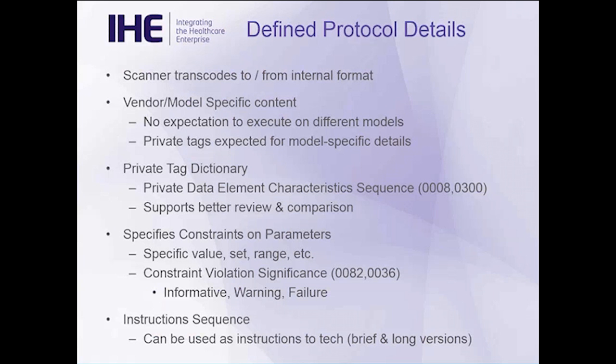So the defined protocol details, if you're a scanner vendor, basically this means you'll implement transcoding to and from your internal format to this DICOM format. It's important to note that the vast majority of these protocols are vendor and model specific.